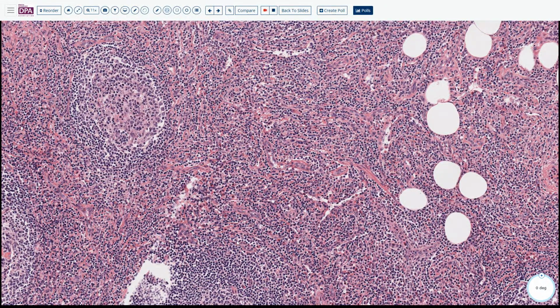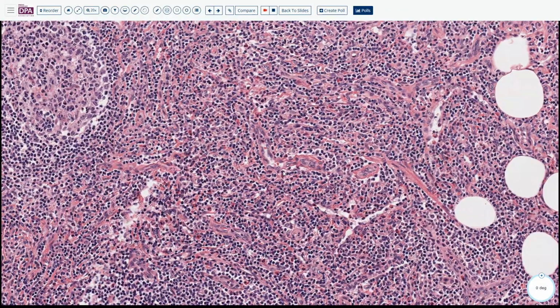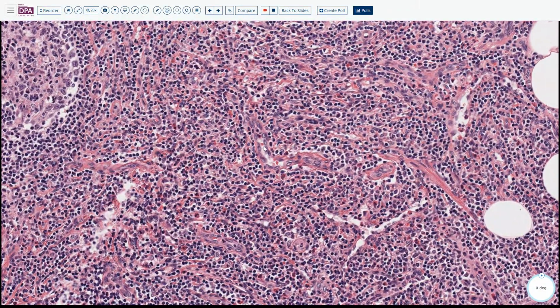this vessel proliferation in this pericortex area, not like the infectious mononucleosis. There were a lot of immunoblasts and mixed inflammatory cells. This one, we have a lot of this vessel. And then this endothelial cell is not like the normal vessel, because it is kind of fat, kind of plump, more epithelioid than the classic spindle endothelial cell. So this is another characteristic feature of this one. So this is Kimura disease.